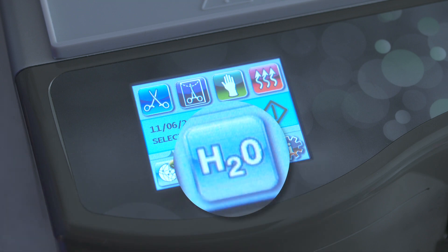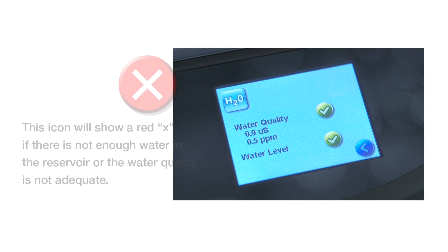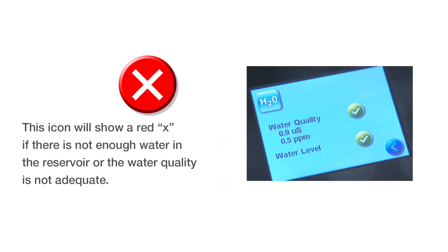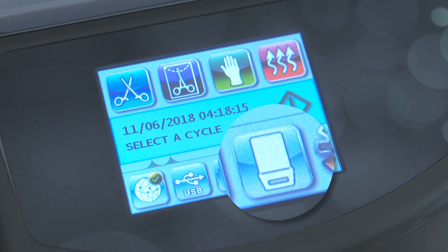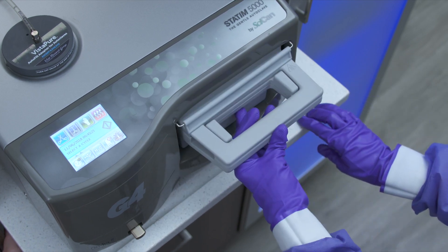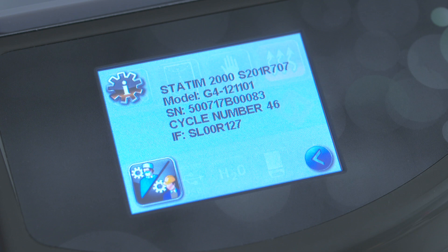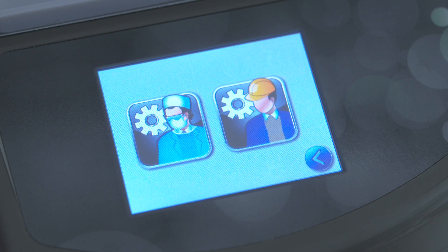The H2O icon is the water level and quality status icon. This icon will show a red X if there is not enough water in the reservoir or the water quality is not adequate. The cassette icon shows you if the cassette is properly engaged. The final icon is the eye icon, which leads you to the settings and unit information page. From this page, you can access the user and technician menus.